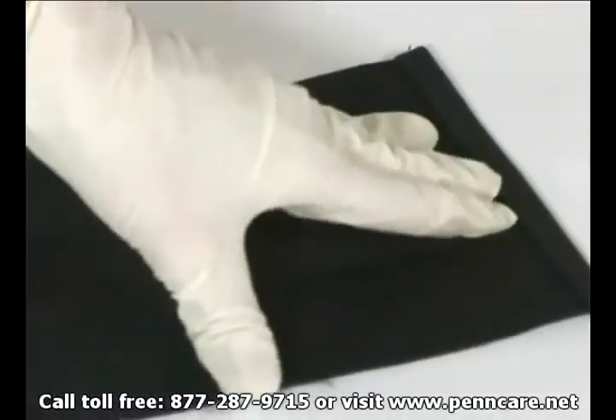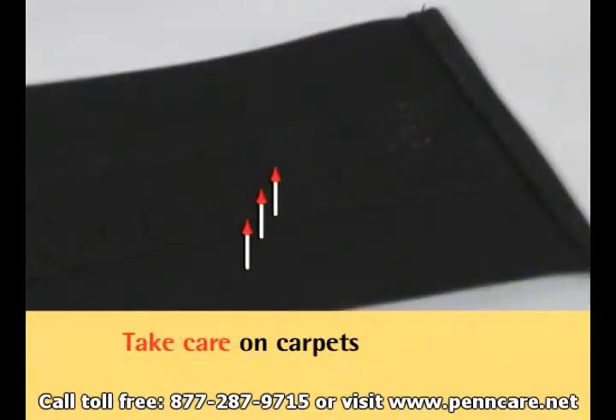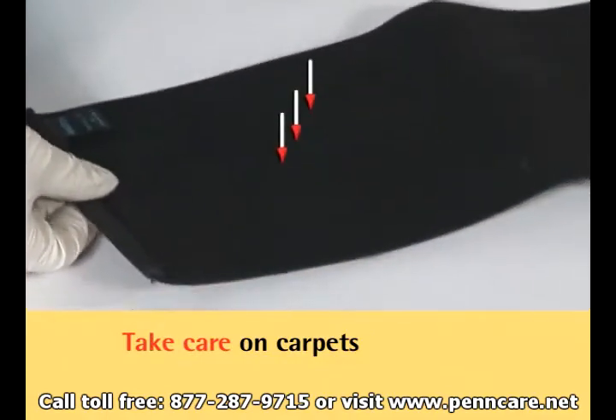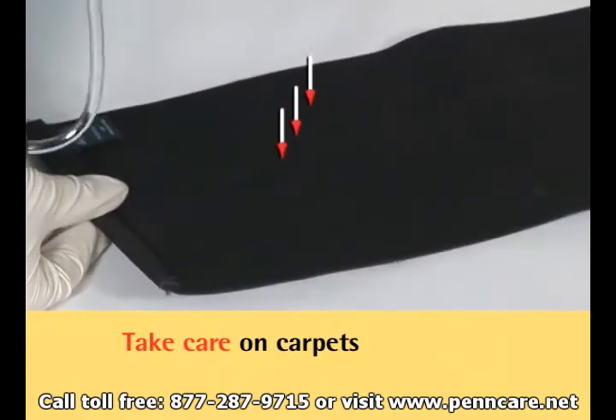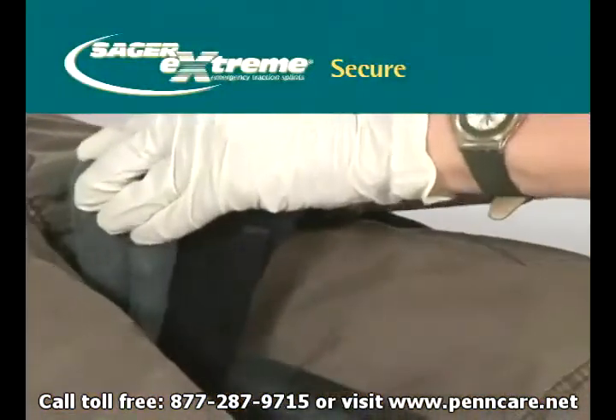As with any device that uses hook and loop fasteners, the cravats may engage on carpet unless care is taken during application. When you insert the cravats under the knee, the hook half of the Velcro fastener faces up on the end of the cravat being inserted. The loop half of the Velcro fastener, therefore, will trail and face down and will not stick to the carpet.